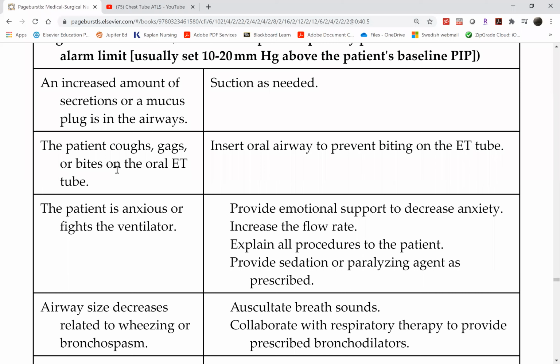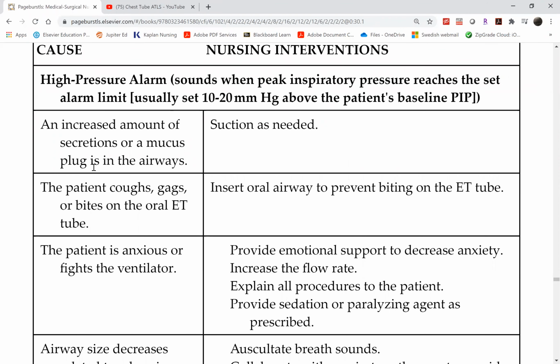When you bite, have an obstruction, a displaced tube, decreased airway diameter, give me one word. Resistance. Okay, there is increased resistance in all of these cases. So the ventilator senses that increased resistance.